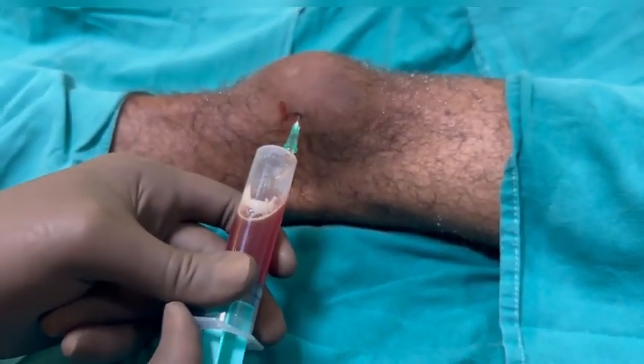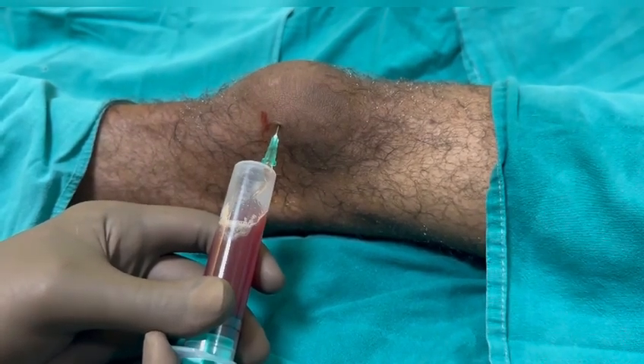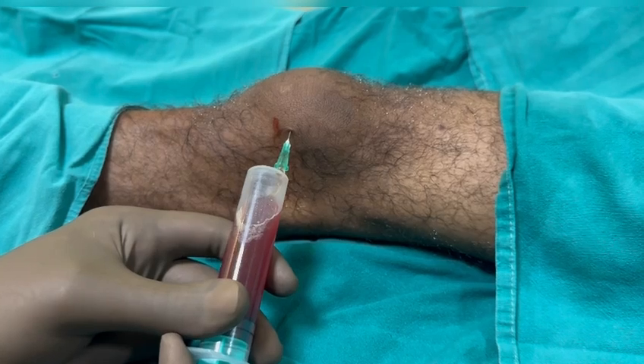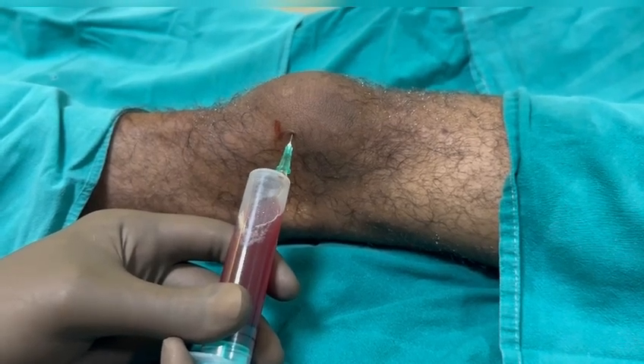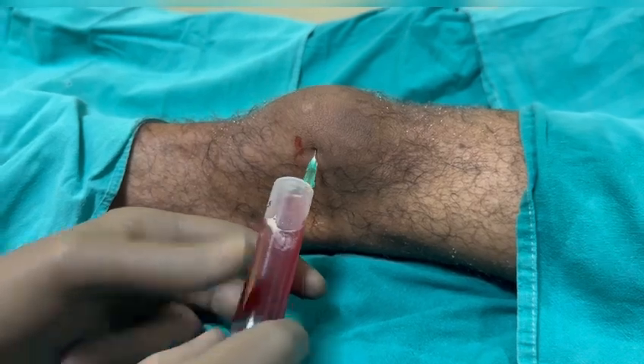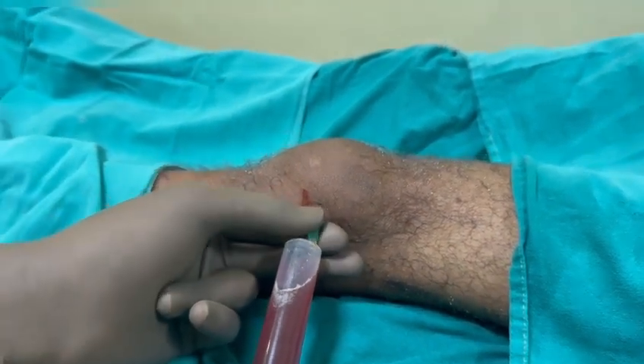Especially with the prepatellar bursa, apply negative suction and you can see that it is still draining the bursal fluid. You need to try to aspirate all the fluid, so be patient. Apply negative suction, and if you have more than 20ml, keep aspirating until you feel that you have aspirated everything.